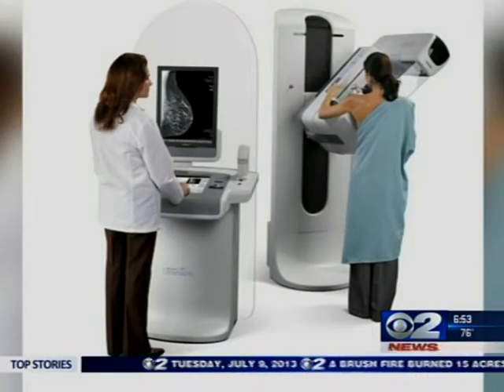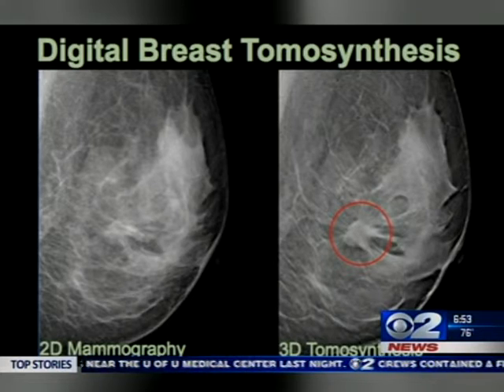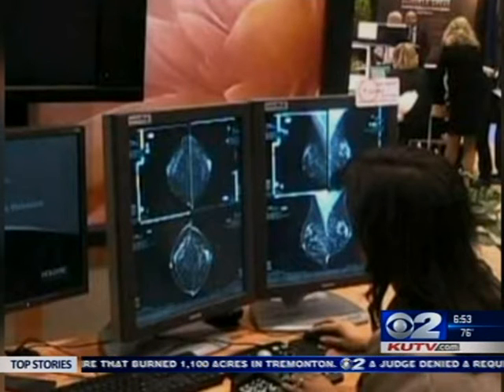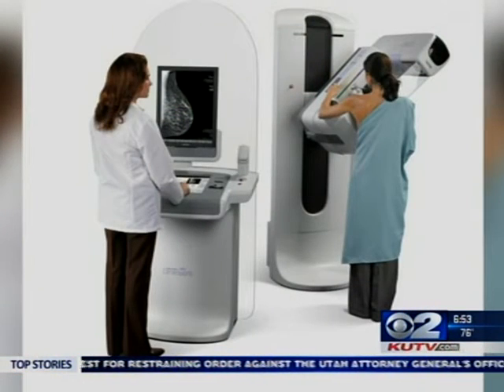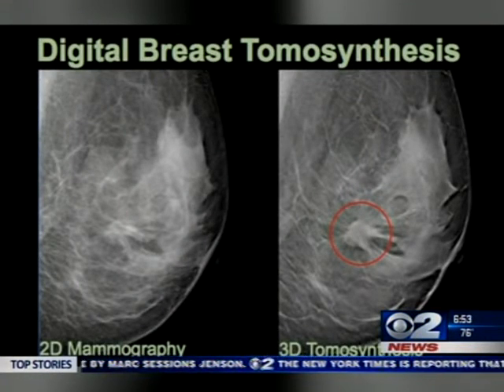And you have a new technology that helps you see things better, right? You're referring to tomosynthesis. Tomosynthesis is both a conventional 2D digital mammogram and a 3D digital mammogram. When we do mammography traditionally, we do two views of each breast. But those views are two-dimensional, and we can miss things because of overlapping tissue. We just saw an example of what was less clear on the regular mammogram, but more clear on the tomosynthesis. With 3D tomosynthesis, we acquire multiple images of the breast from different angles, and we synthesize them into 1 millimeter slabs.